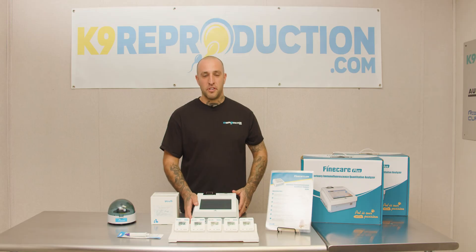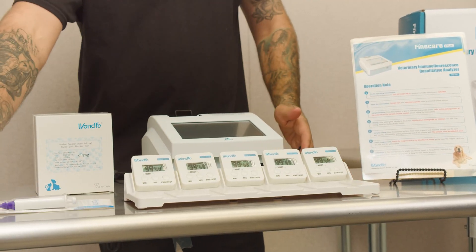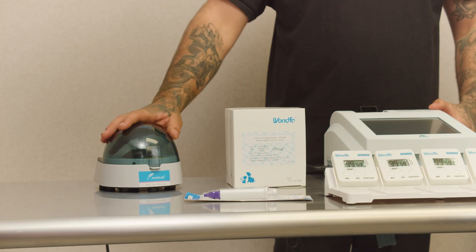What's included when you purchase a WANFO bundle from us? We include one timer tray with five timers, one 75UL pipette, and two boxes of tests containing 10 tests in each box, plus one 10K centrifuge.